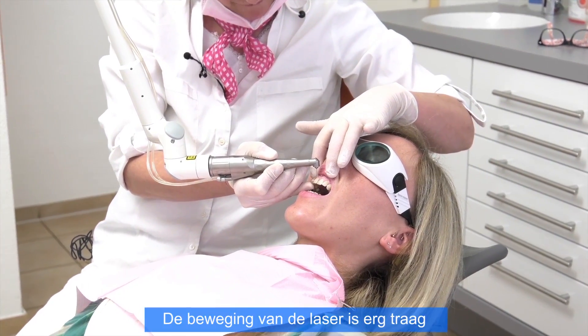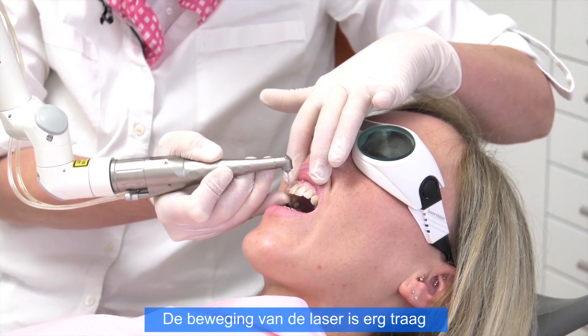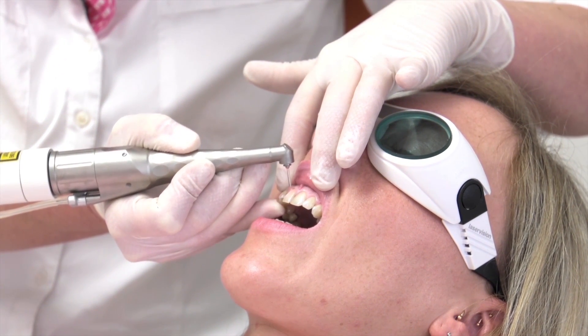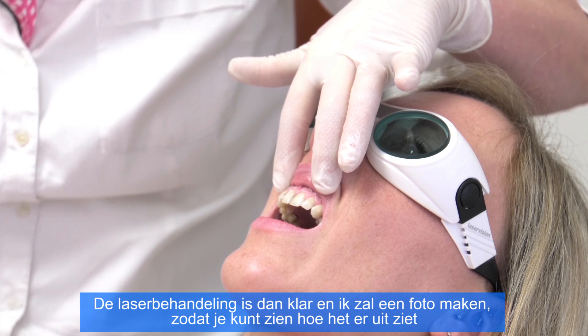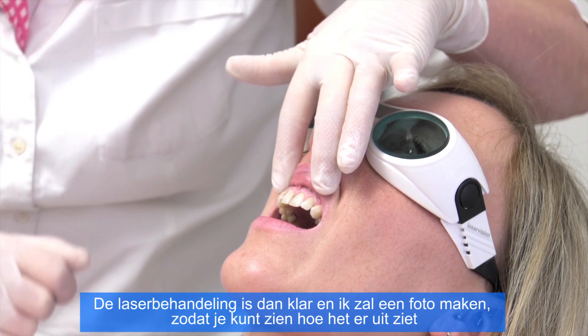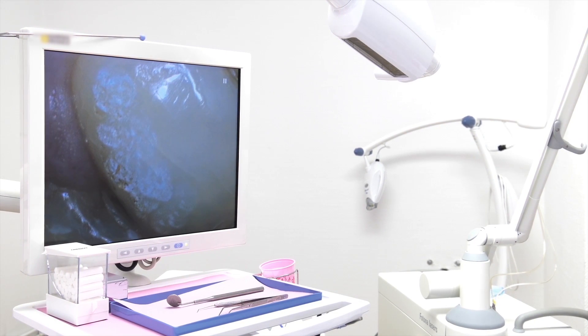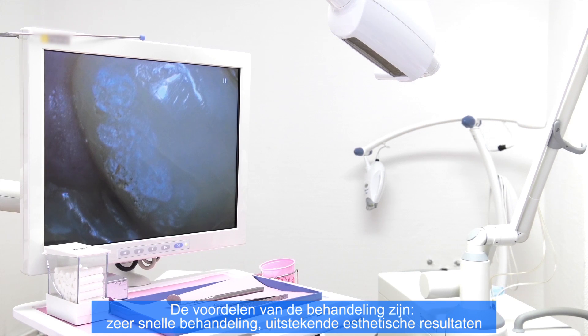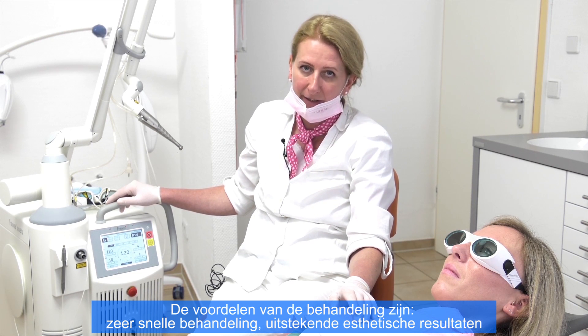You can see these are very slow movements over the surface of the incisor. We are already finishing the preparation, and we make a picture so you can see it better. The advantages of laser preparation: it works very fast — you could see it. The second is you get a very nice aesthetic result. And you don't need any chemicals when making the fillings.